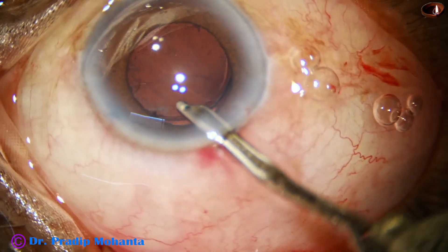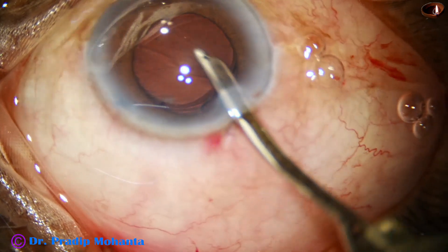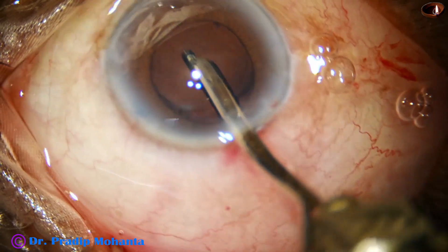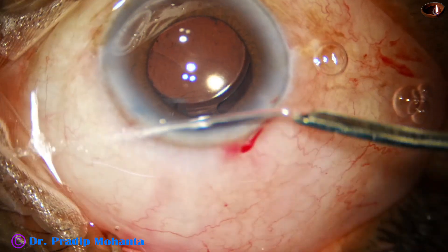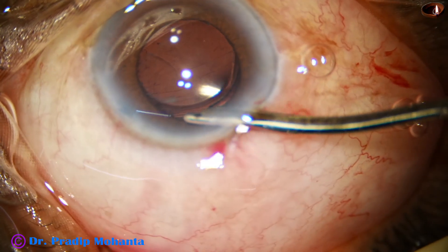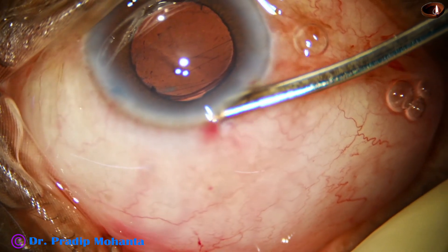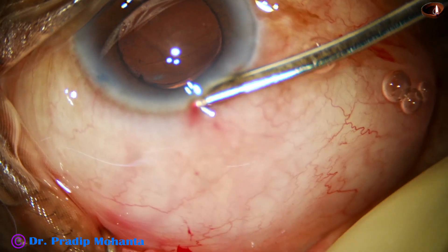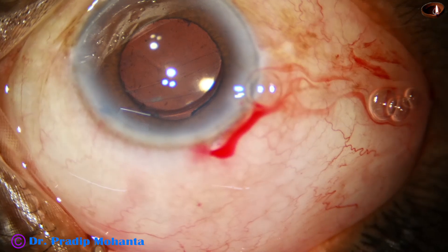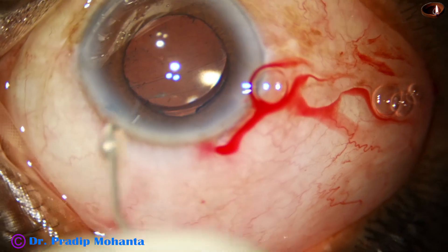The lens is looking a little decentered because the inferior iris has contracted more than the superior iris. But the lens is nicely centered, and as I form the anterior chamber, the lens becomes more centered. It is done and just a little bit of moxifloxacin is to be injected through the side port, and the case is going to be concluded.